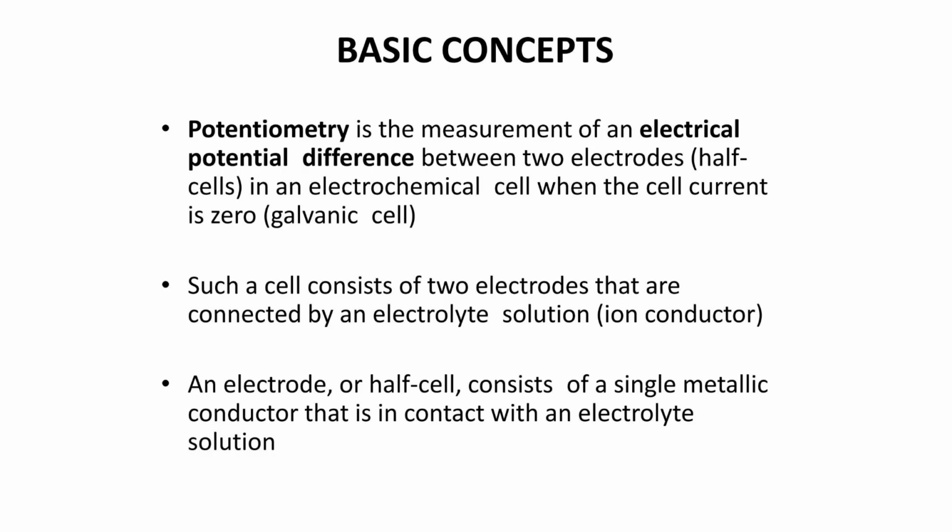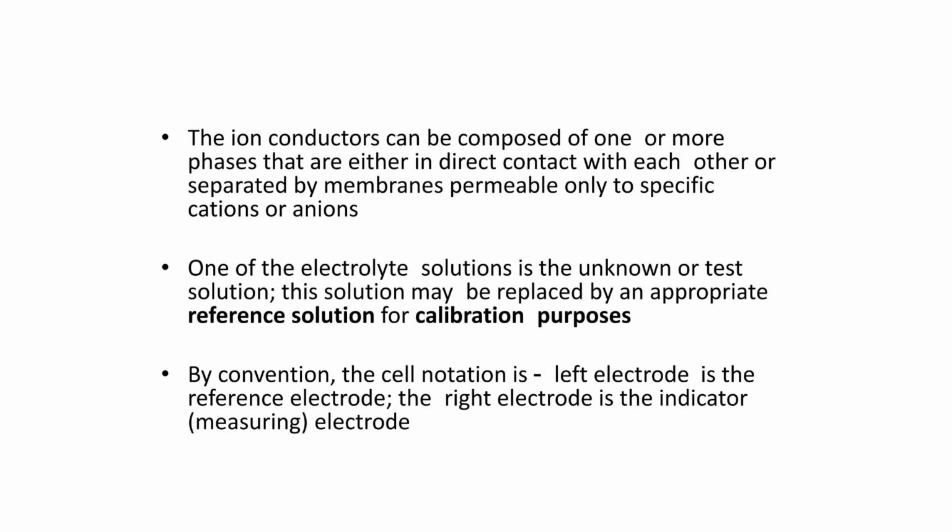A clinical example is the potassium selective electrode, which integrates natural as well as neutral antibiotic carriers. This enables an incredible selectivity ratio, allowing clinicians to measure blood potassium accurately even in massive background sodium concentrations.